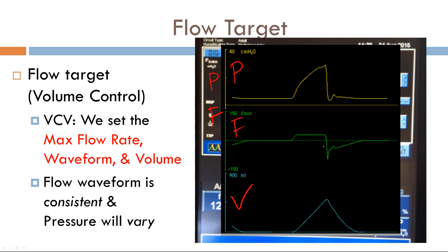So this is a constant ramp, which means flow is the target variable in this mode. Which mode of ventilation uses flow as a target variable? That would be volume control. Without any other information, just by looking at these waveforms, I can tell you that the mode of ventilation for this patient is volume control.